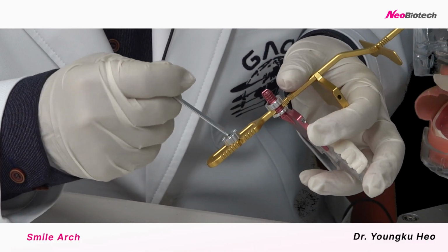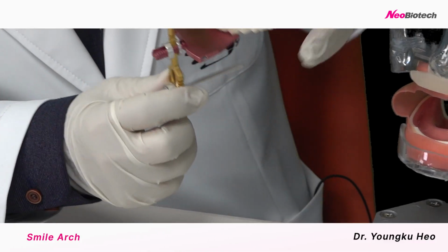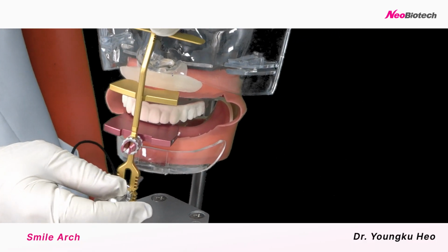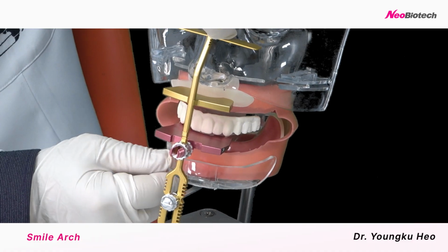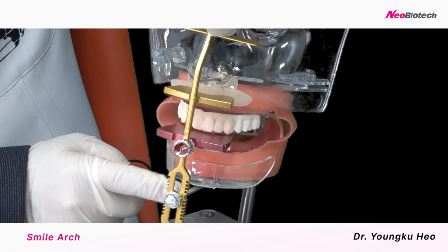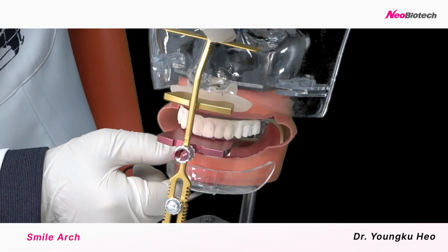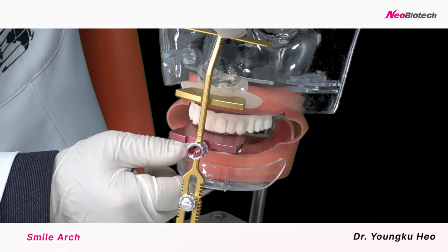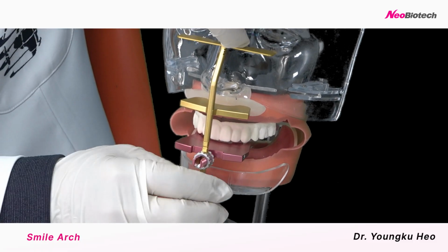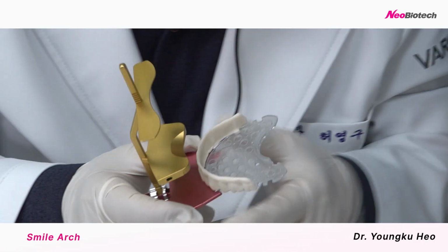Okay, you can put it here, and then let the patient, we guide the CR position just in the vertical dimension. Okay, there's a CR record. Okay, we can take this out.